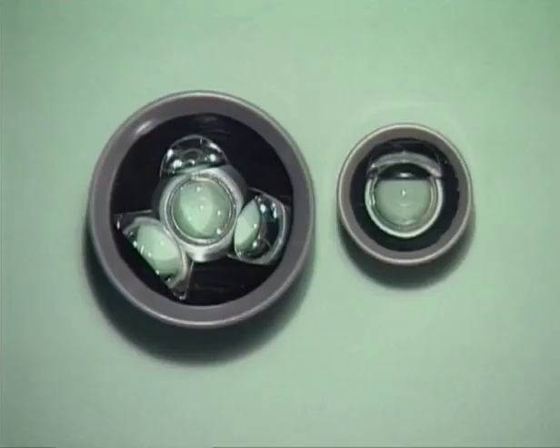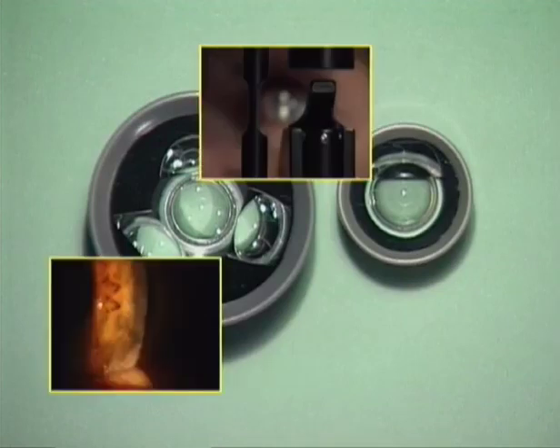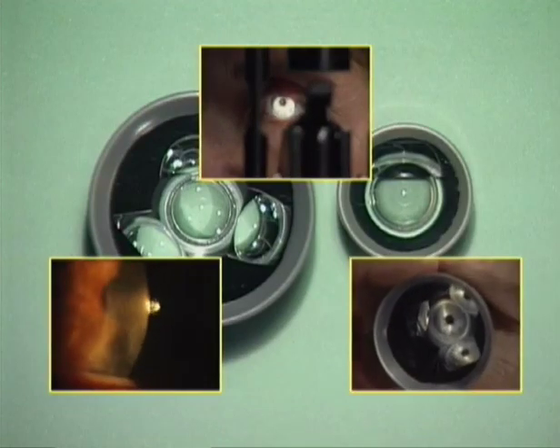This is the end of the examination of the chamber angle with the slit lamp. Introduction to the use of gonioscopic contact glasses. It is part of a series of instructional videos devoted to the biomicroscopy of the eye.